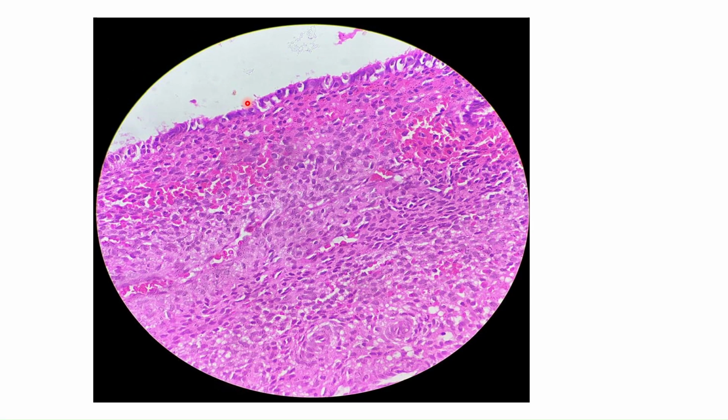Here you can appreciate the surface epithelium, and beneath this surface epithelium is the stratum compactum. In the stratum compactum, the stroma is well responsive to hormone and it shows pre-decidual change, showing vesicular nucleus and abundant eosinophilic cytoplasm with boundary. Here you can appreciate spiral arterioles.